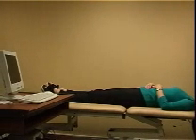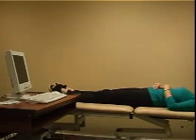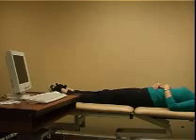However, neither of these latter techniques quantify torsional eye movements such as those seen in posterior and anterior canal BPPV. Three-dimensional recording systems do exist, but are not in routine clinical use. Therefore, even when using ENG or VNG, the eye movement should be observed by the tester to correctly diagnose BPPV.